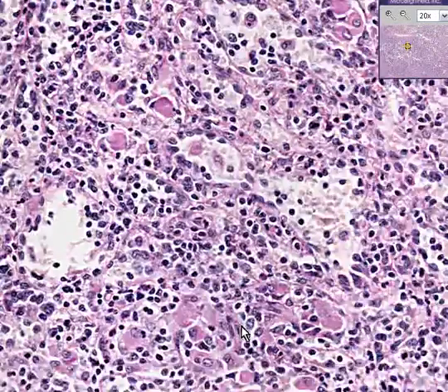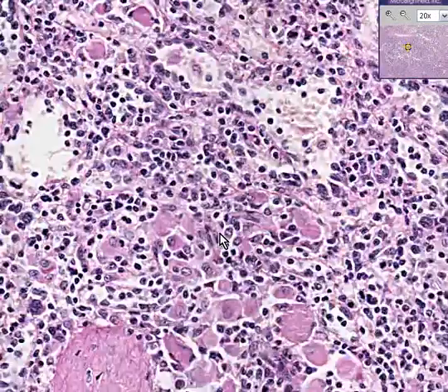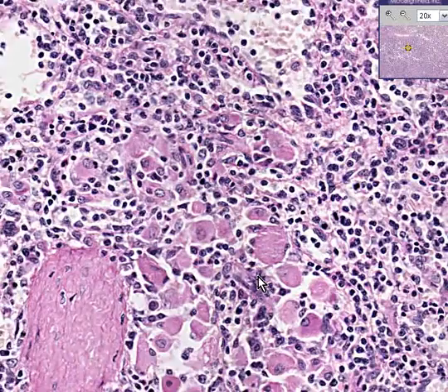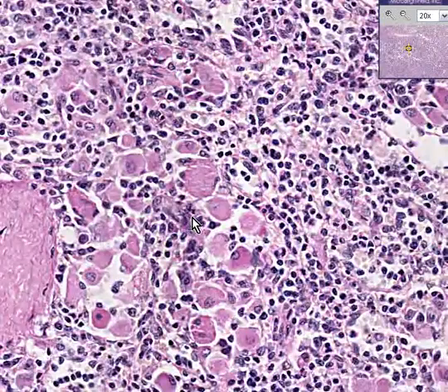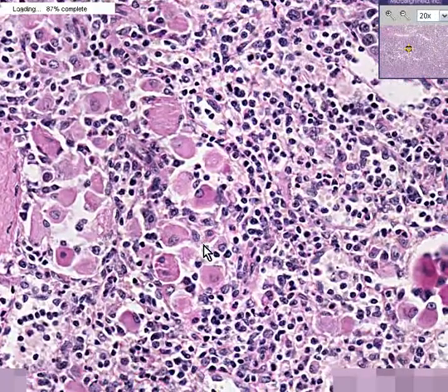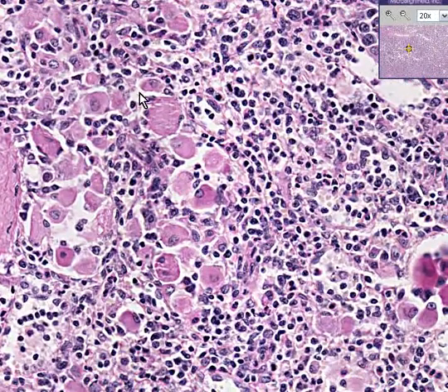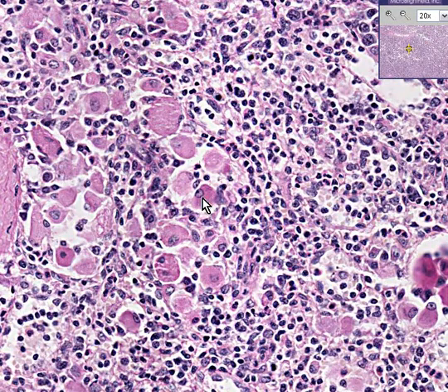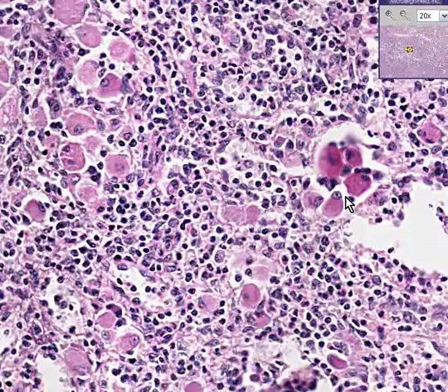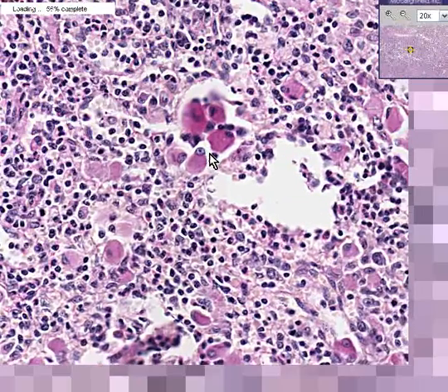Sure, occasionally you could see some plump macrophages chewing up all the things they're supposed to chew up, but this spleen is enlarged chiefly due to the presence of these foamy histiocytes or macrophages being all over the place.